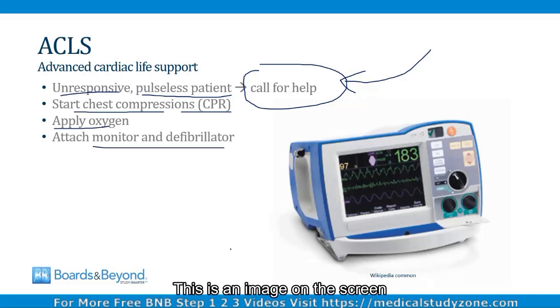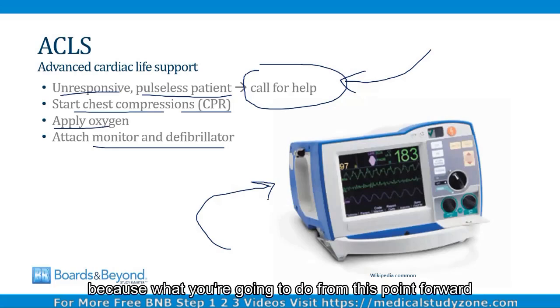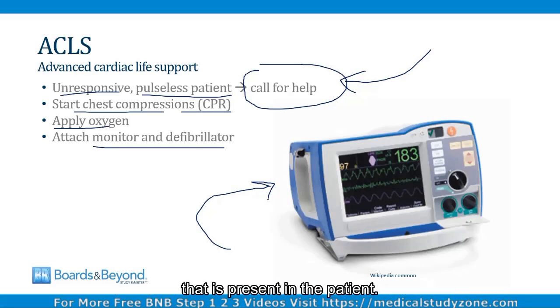and defibrillator. This is an image on the screen of a heart monitor defibrillator. These are found throughout hospitals. And this step is very important because what you're going to do from this point forward is going to depend on the underlying heart rhythm that is present in the patient.